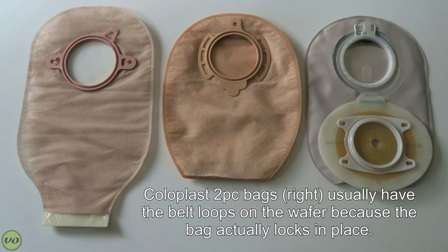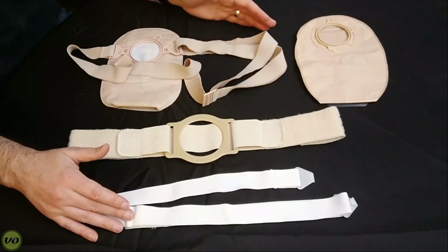to be helpful. Now keep in mind that these are meant to attach to specific bags that have belt loops. Not all bags have belt loops, although most, if not all, two-piece systems will. One-piece systems don't tend to have these belt loops because the whole idea of these is to support your bag from actually coming off. So as you can see, I've got a couple of different styles of accessory belts.